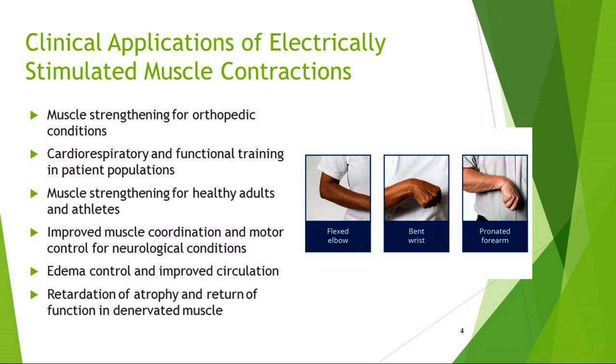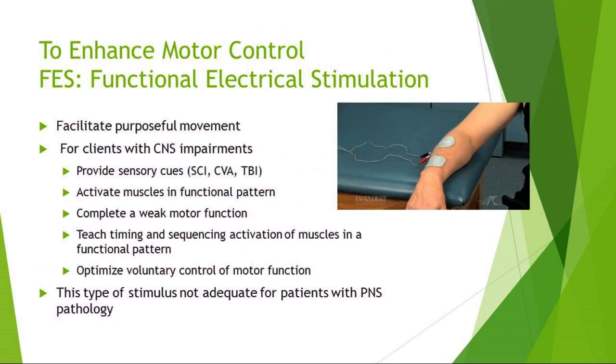So these are some synergy patterns that you might see in people with different neurological injuries, and we're going to use electrical stim to counteract those synergy positions.